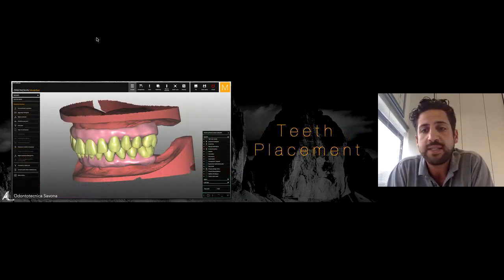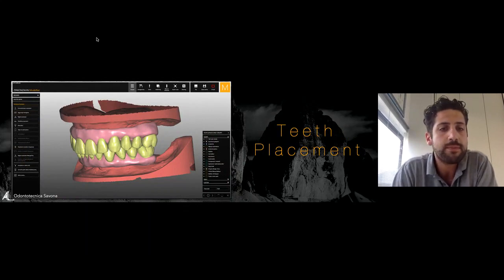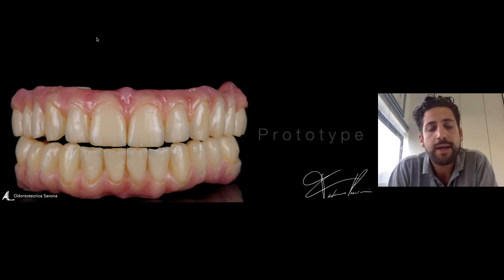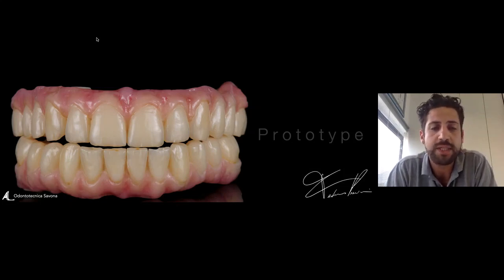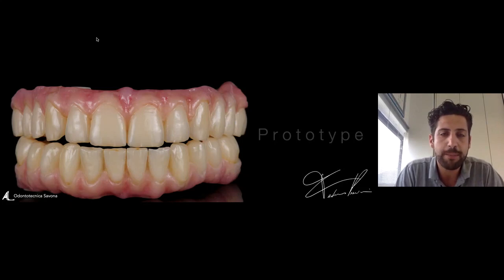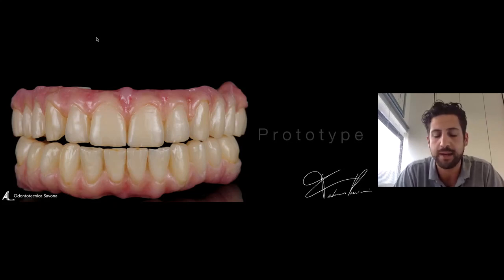Okay, let's see. This is the teeth placement of the full arches. And after the placement, we milled the two structures in multi-stratum flexible. We also made the layering of the composite on top just to make the prototype. In that way, the doctor can see the aesthetic of the patient, can see the occlusion, and can also make some modification if we get some mistake.